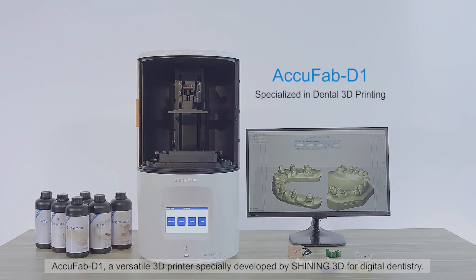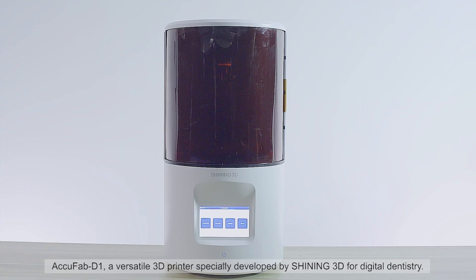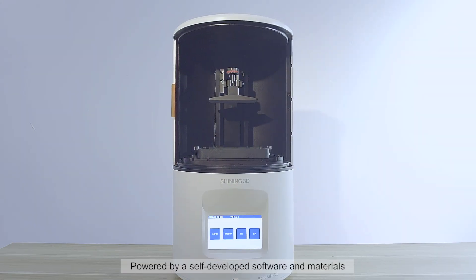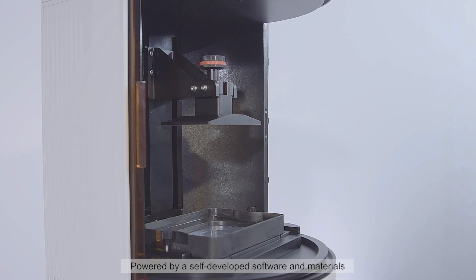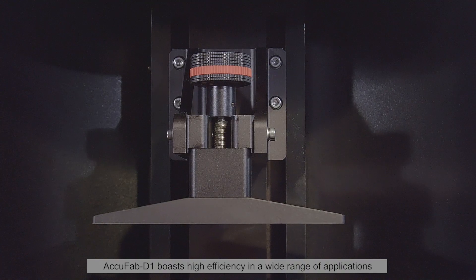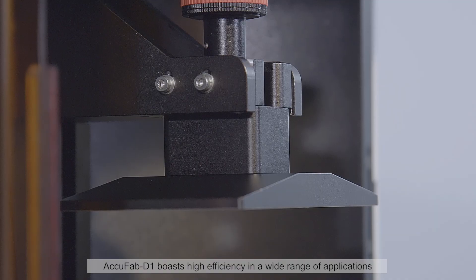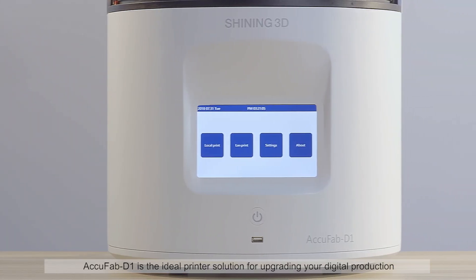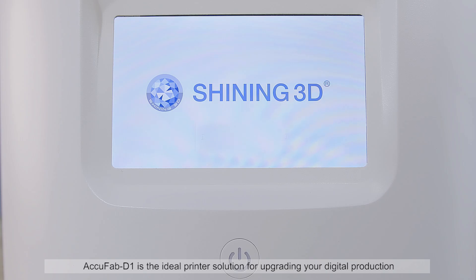AccuFab D1, a versatile 3D printer specially developed by Shining3D for digital dentistry. Powered by self-developed software and materials, AccuFab D1 boasts high efficiency in a wide range of applications. AccuFab D1 is the ideal printer solution for upgrading your digital production.